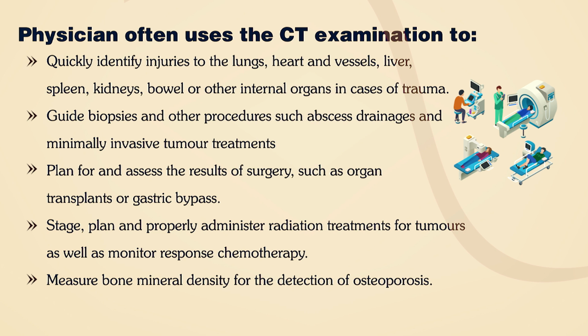Stage, plan and properly administer radiation treatments for tumors as well as monitor response to chemotherapy. Measure bone mineral density for the detection of osteoporosis. Now, I am going to compare CT scan with MRI scan.